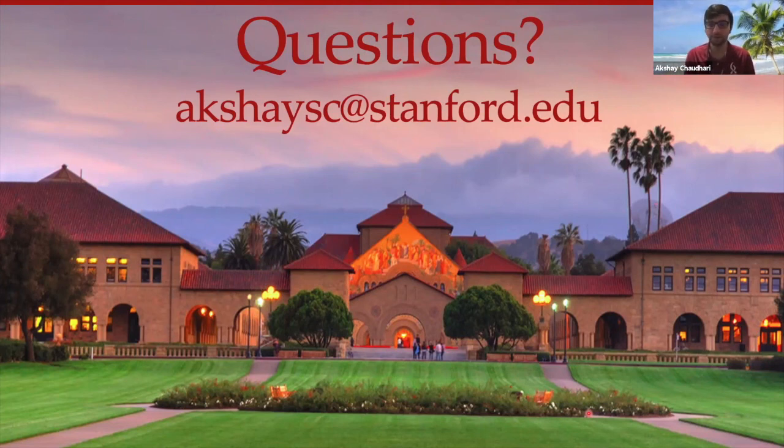But in the context of the question and in looking at temporal changes, that's a good question that I don't think we have a very good sense for, especially in a large population, which is how early can we see the changes? And the reason we don't really have a very good answer is because we've never been able to apply these techniques in a broad population because it's just too expensive to scan with it. There's some smaller cohort studies that show that we start seeing changes in cartilage T2 roughly 2 to 3 years before there's any morphological changes that are visible.